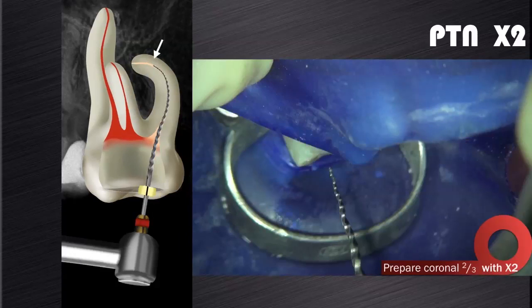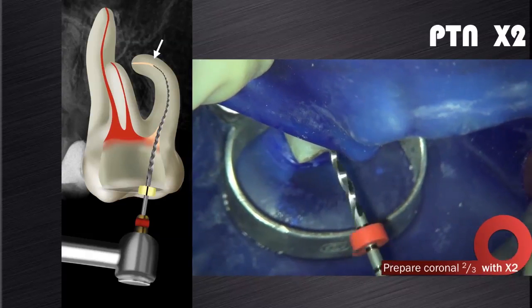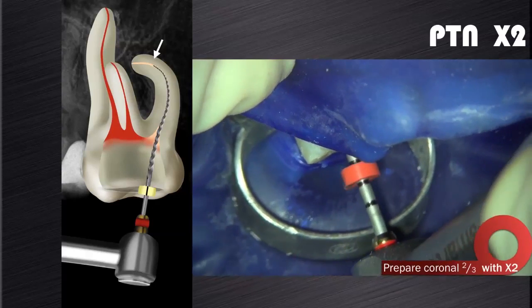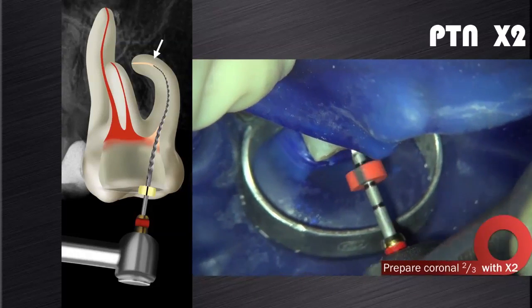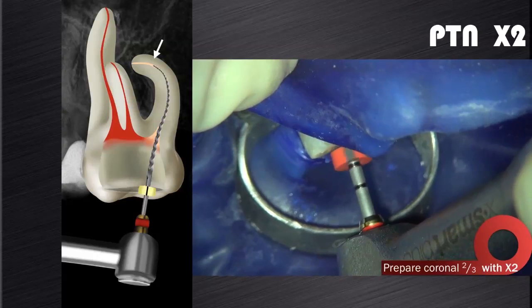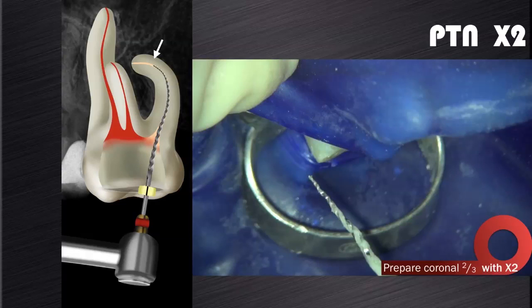Now here is my clinical tip. Instead of going back to the X1 for a second cutting cycle, I would recommend to you to introduce the ProTaper Next X2 and brush your way down to the same level as where the X1 previously hung up in the canal. Then again, after that, check patency and irrigate and clean the flutes of the instrument.